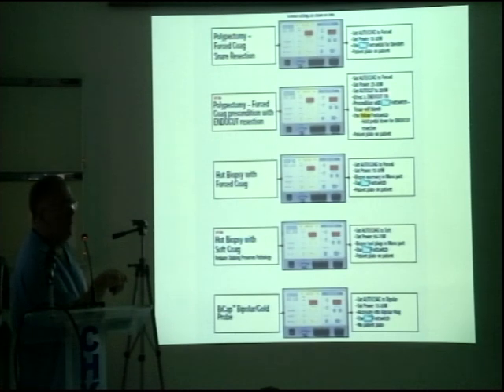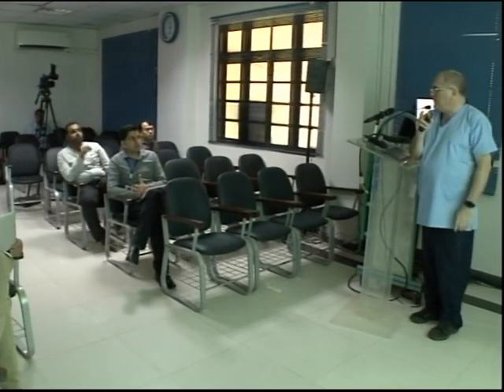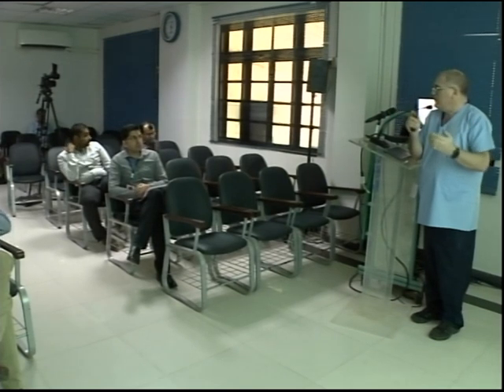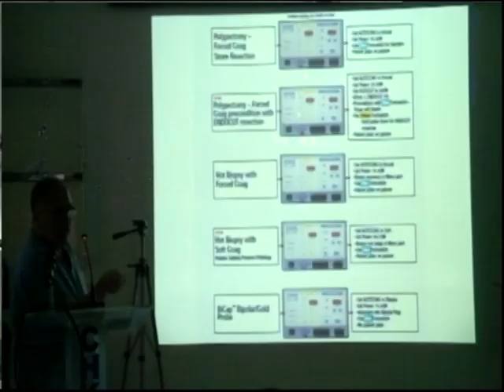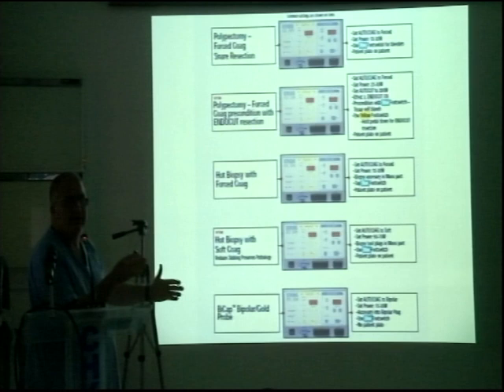You have to be aware of it, because if there is an effect setting on your diathermy, that's what it does. It's like using a hose pipe: you have the hose pipe on 2 litres per minute, and you have it on jet. That shoots forward. You still have it on 2 litres per minute, and then you adjust the hose pipe to be on spray. So it's less force behind it. More force is 1, less force is there, but there's a greater area affected.